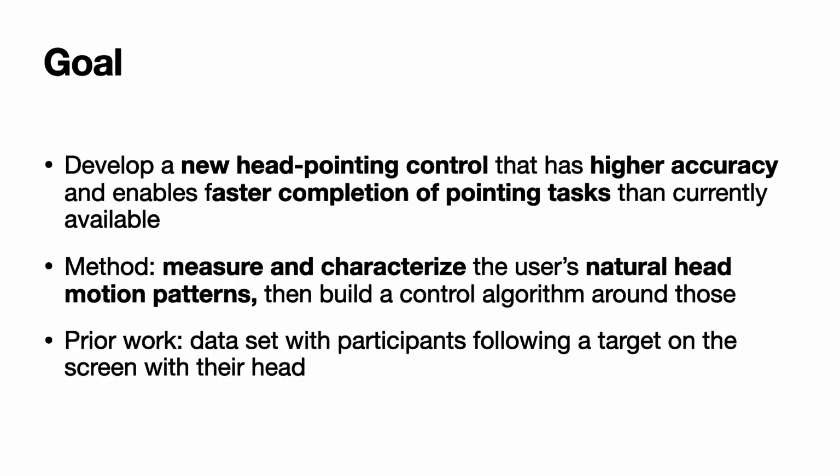Our research aims to develop a new head pointing control that has higher accuracy and enables faster completion of pointing tasks than currently available. Our proposed method is to measure and characterize the user's natural head motion patterns and then build a control algorithm around those.